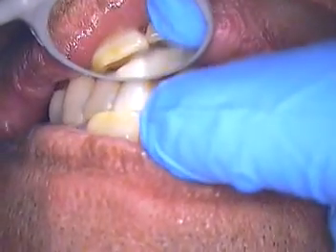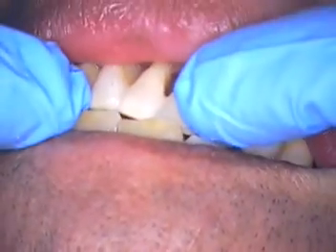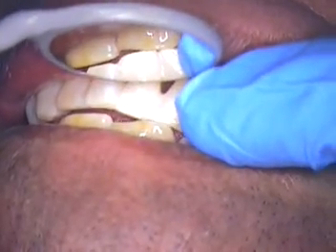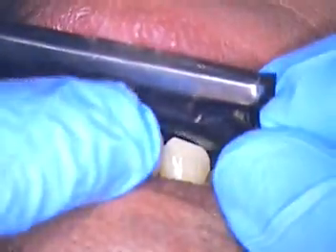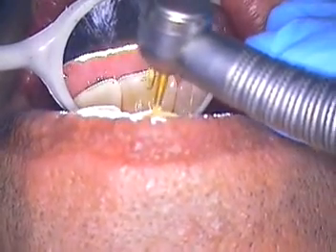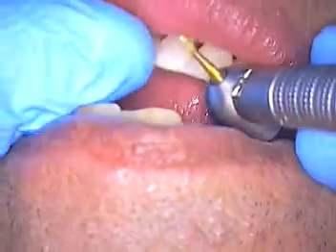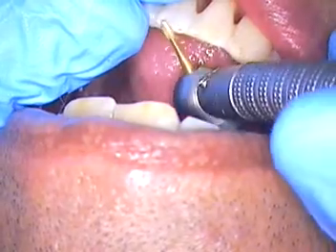Can you slide your bottom teeth forward? Just have them touch. Like that, and go back. Hold it right there. Now tap, tap, tap right there. We're going to put the paper in right there. Open a little bit, now tap, tap, tap right there again. I'm just going to see if you need just a little adjusting on the upper, and then I'll turn around on the bottom. Looks like you're good. I think we're pretty good, don't you think?